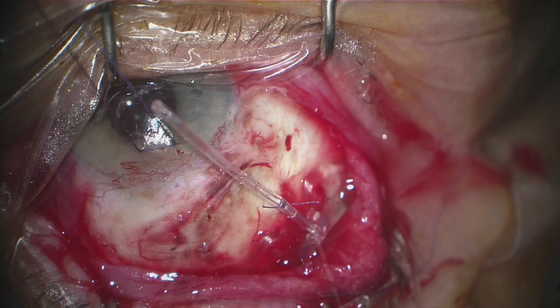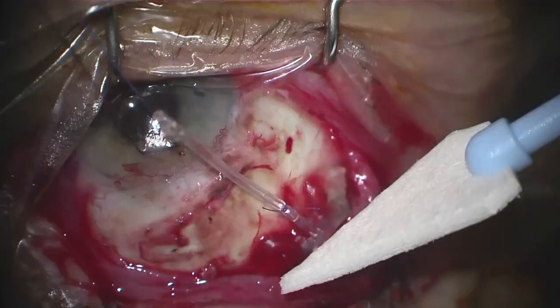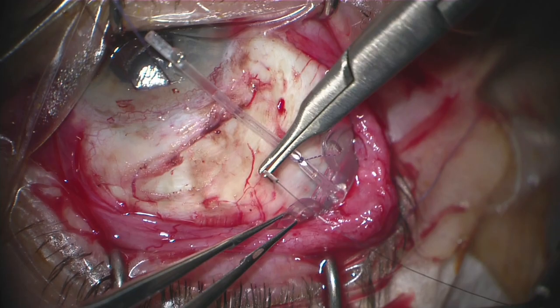It's very important for these non-valved implants to have this ligature in place and it needs to be watertight. As you saw there, we just confirmed it by priming it with balanced salt solution on a cannula, and we saw that there was no movement of fluid posterior to that ligature.